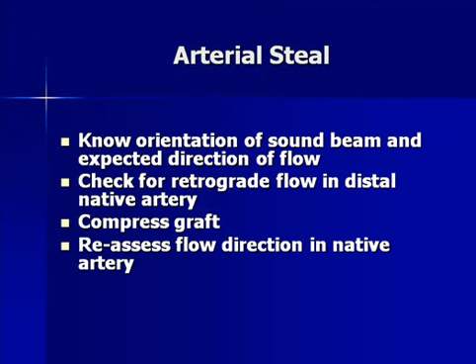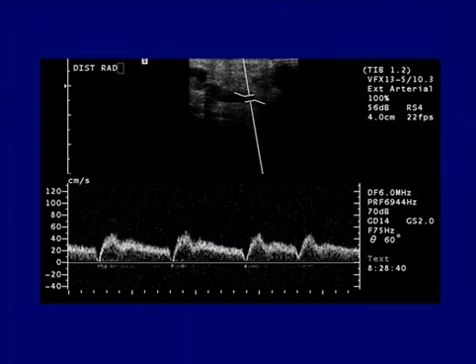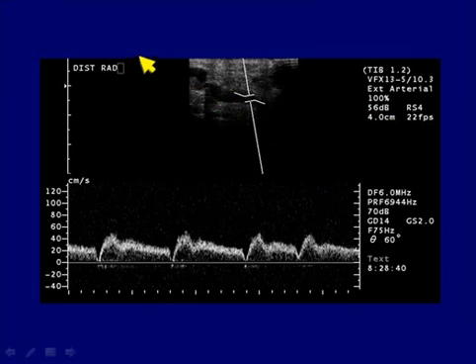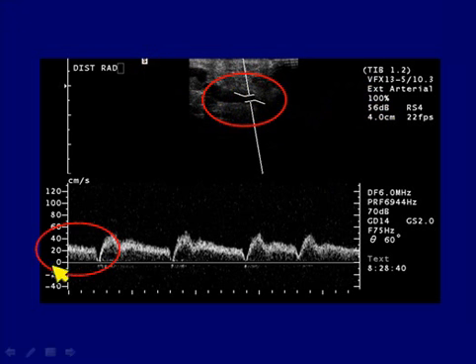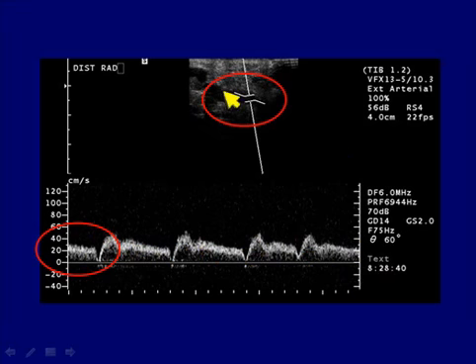Another complication in fistulas is arterial steal. It's important to know your orientation carefully. In this example, with the head up and hands down, flow should be going toward the hand — away from the transducer — so we'd expect a negative Doppler shift. But here we actually see a positive shift, meaning flow is coming from the hand back to the fistula. That's a patient who needs this problem addressed.